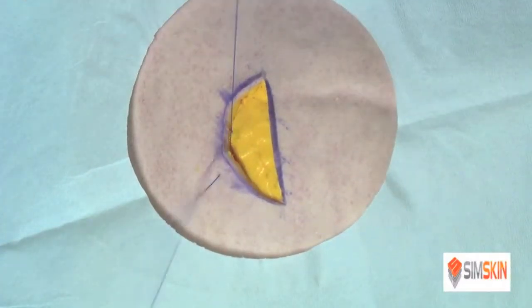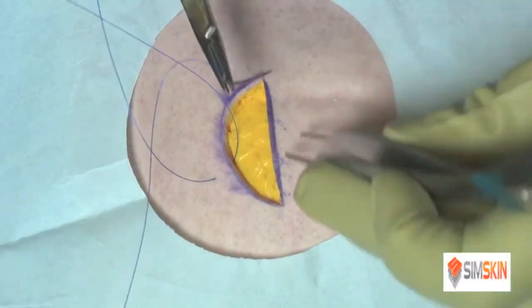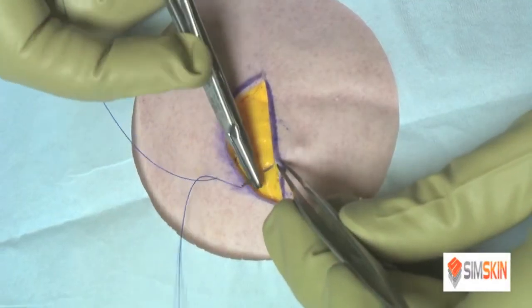This stitch is commonly used in situations where there's a high tension wound, such as on the scalp.